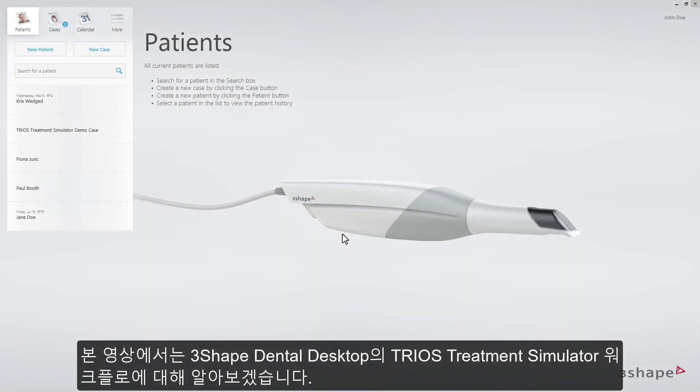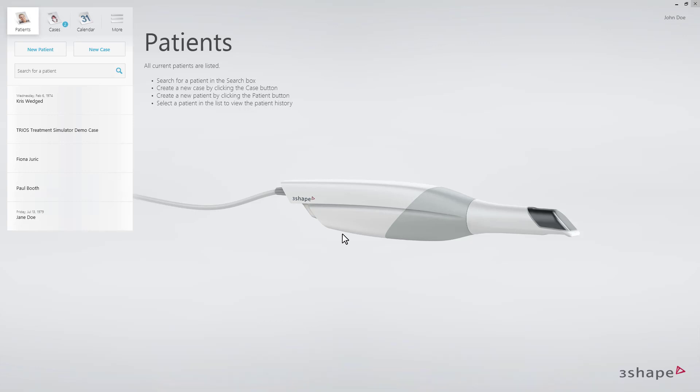This video will demonstrate the workflow for TRIOS Treatment Simulator in 3Shape Dental Desktop.